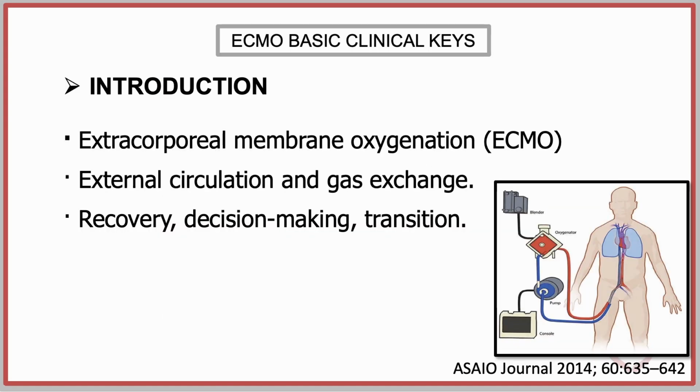Extracorporeal membrane oxygenation, also known as ECMO by its acronym, is a form of temporary mechanical life support used in critically ill patients with severe cardiac or respiratory failure that is refractory to conventional management. It functions as an external artificial circulation and gas exchange system, allowing time for recovery, decision-making, or transition to more definitive therapies such as durable ventricular assist devices or transplantation.